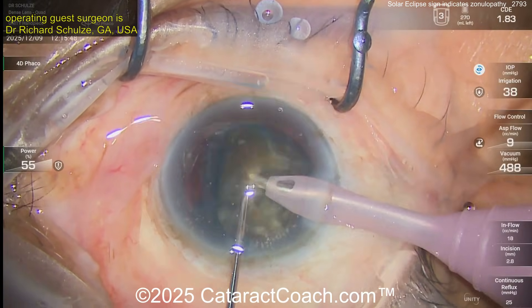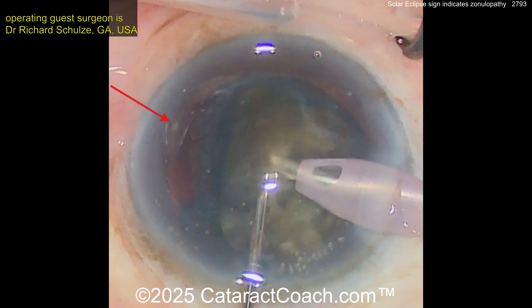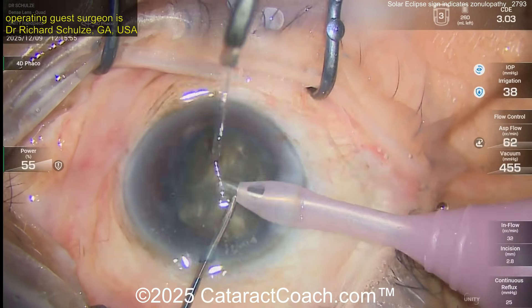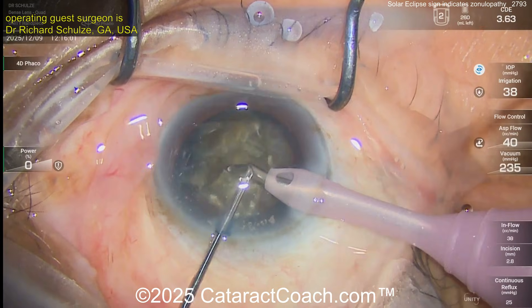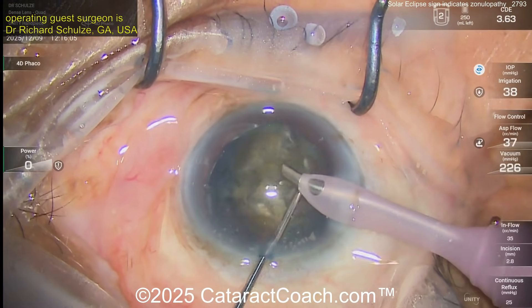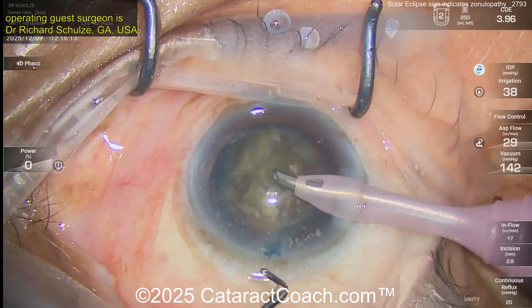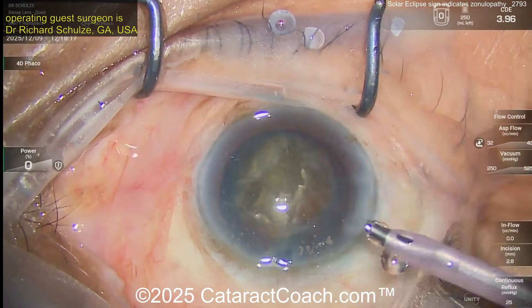Removing the first piece — now look at the capsulorrhexis: why is the rhexis moving when it didn't move before? Because the nucleus that was in the bag was holding the capsule open. As you take out nuclear pieces, you may get collapse of the areas of zonulopathy.